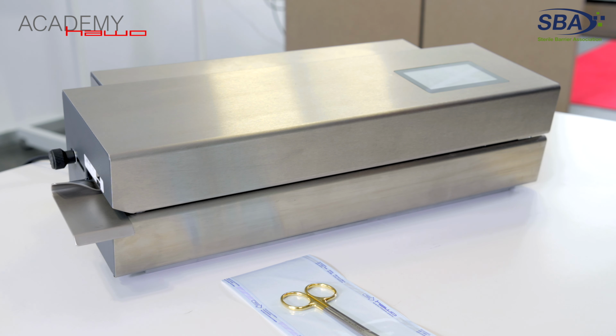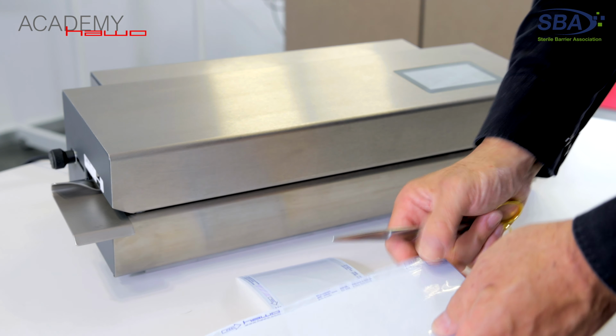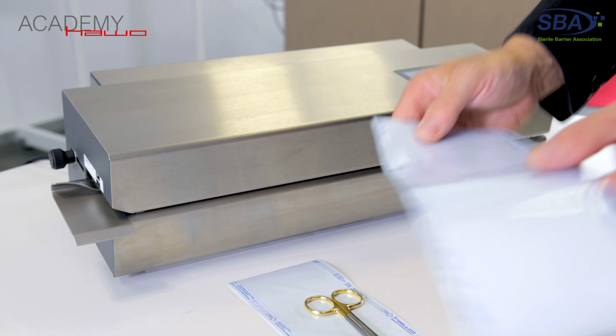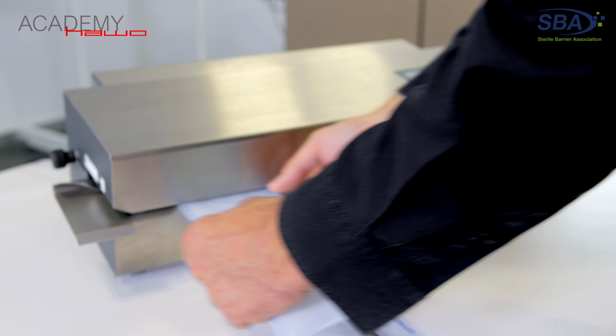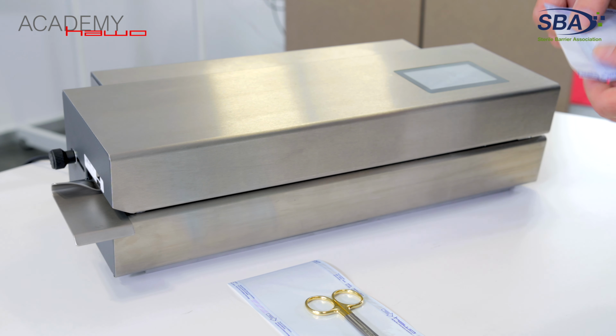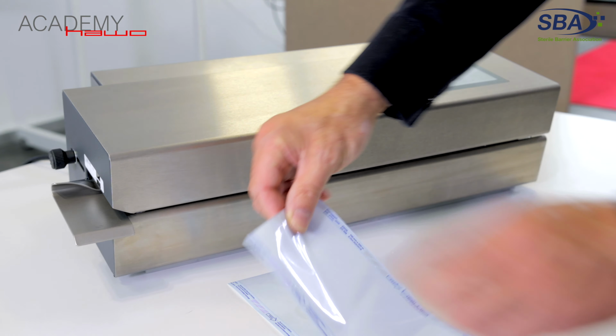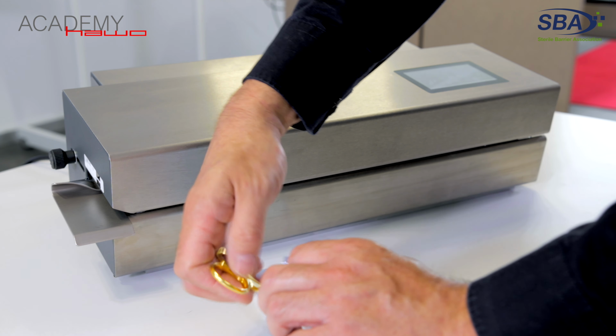And to start, I will easily switch the printer function off, as we now want to do our closure seal. So just run the film into the sealer. First seal is done.